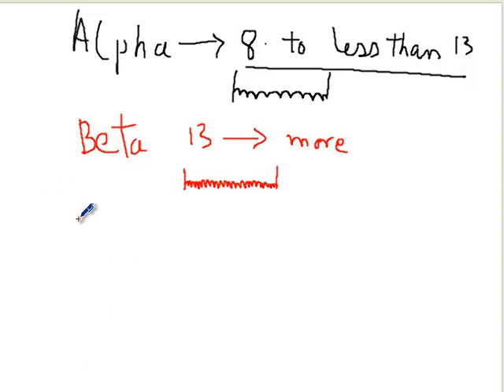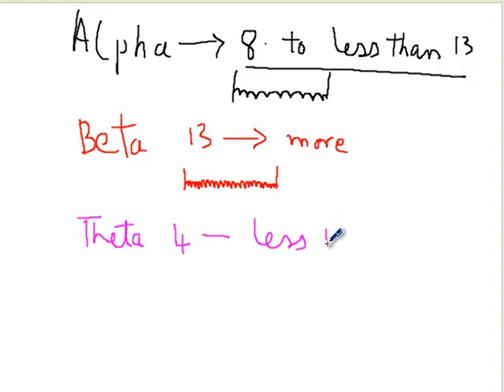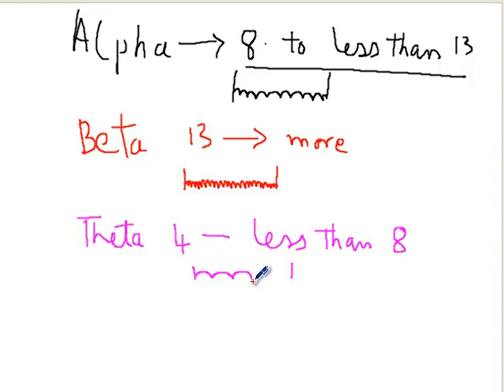Theta frequency ranges from 4 to less than 8 Hz. So if this is one second apart and you count the waves — one, two, three, four, close to five waves in that one second — you call it a theta frequency.